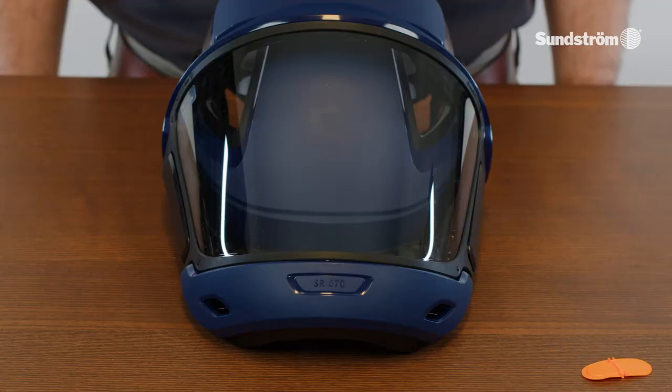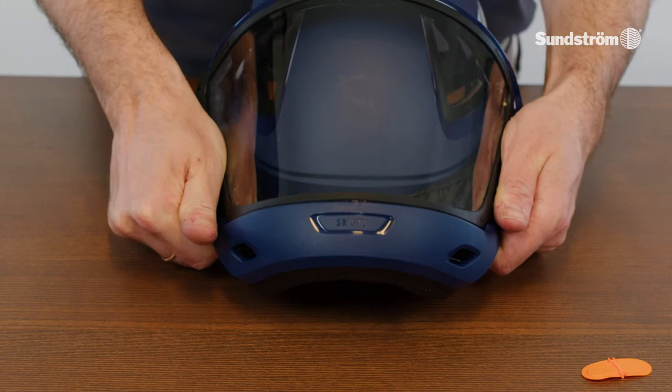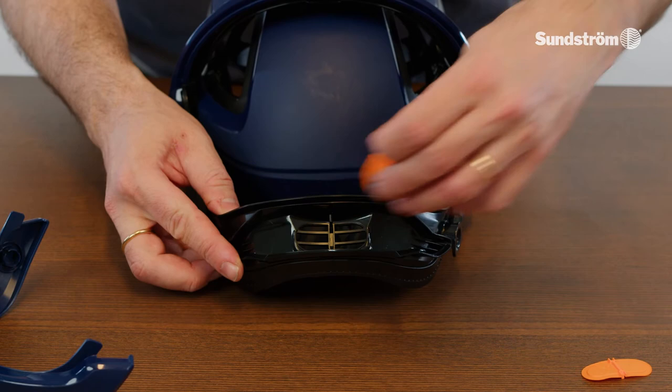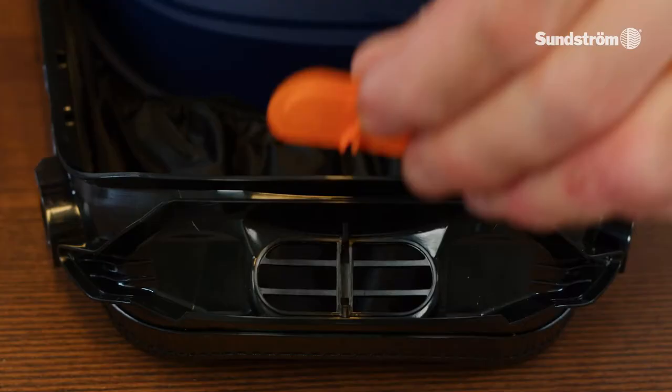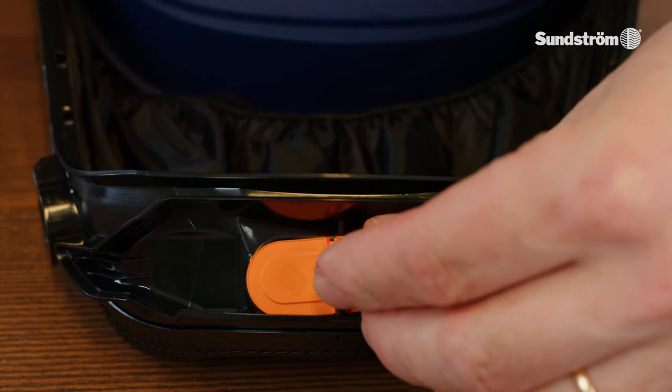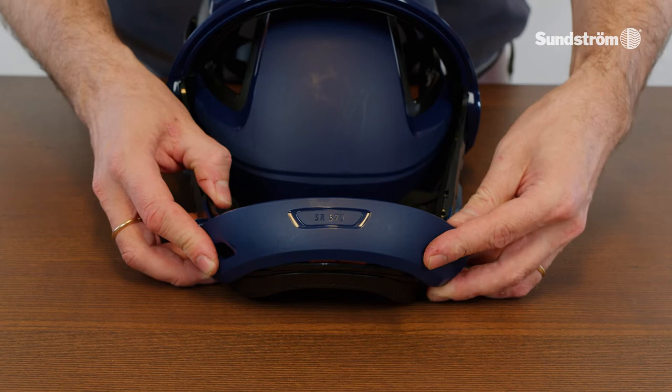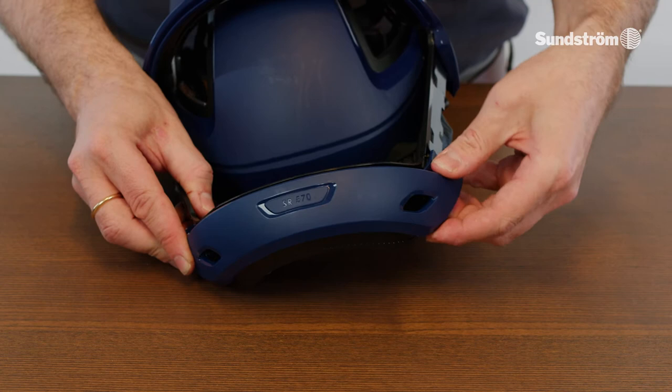Change the exhalation membrane. Remove the visor and the valve cover. Remove the membrane. Press on the new membrane in the right position — the text 'UP' on the membrane should be visible when mounted. Check that the membrane is in contact with the valve seat all around, then press the valve cover into place.